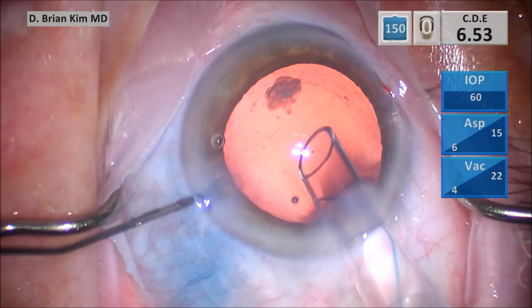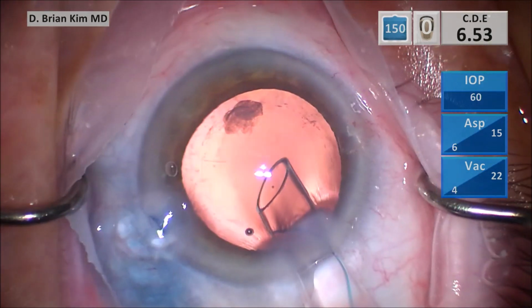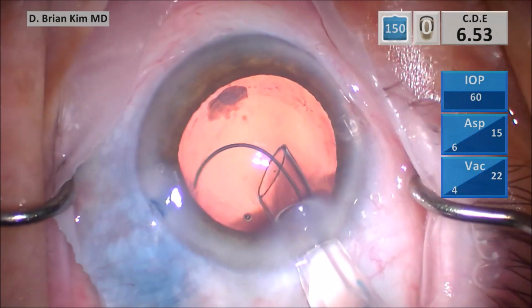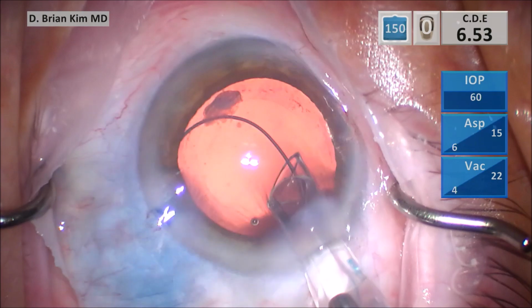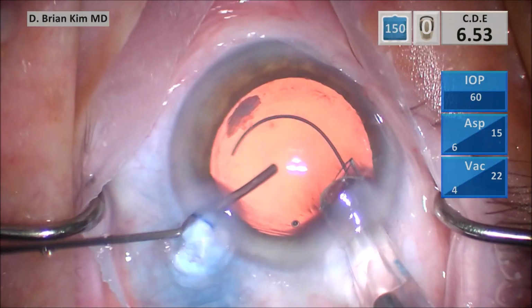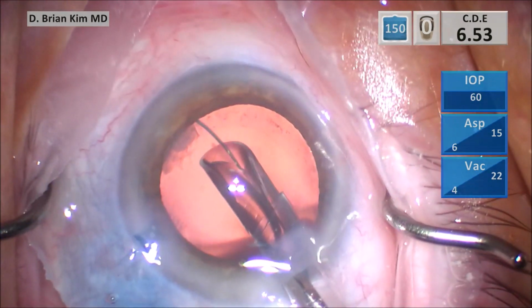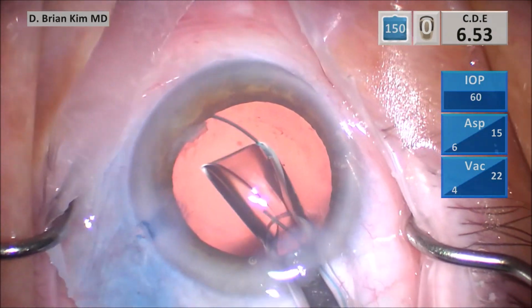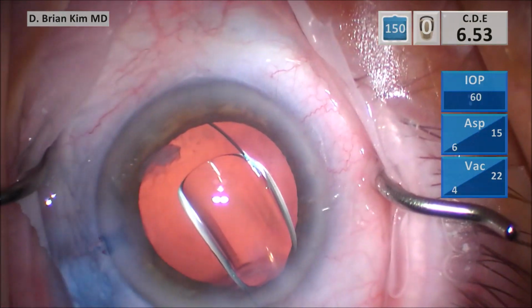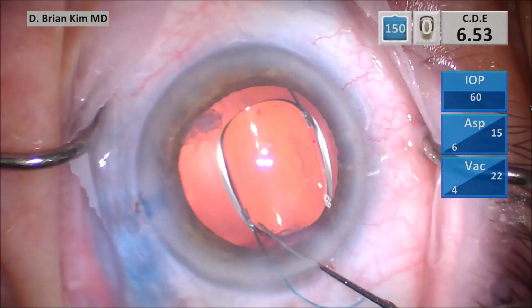Again, the posterior capsule is tending to come up, and so I had to inject some more viscoelastic. As I do this, the bag is deeper now. But I had to go in again because I feel like the viscoelastic is coming out and the posterior capsule is coming upward. I quickly deliver the leading haptic within the bag. Once the leading haptic is in and the optic is delivered, I go ahead and deliver the trailing haptic.